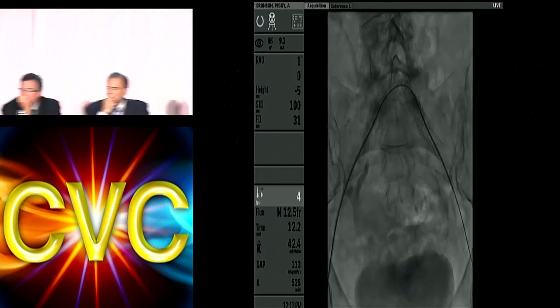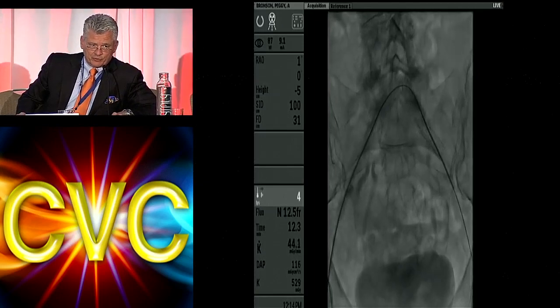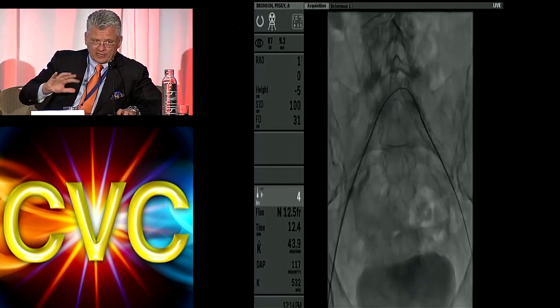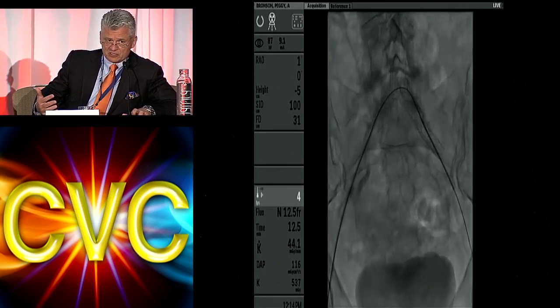So far, you've tried two wires, right? I think you still have wire options here. I wouldn't give up on the wire first. I would even try a Lundequist, one of those very stiff coat hanger wires, and if you can get it across, I think you may be able to remove it. But I would not puncture unless I had exhausted my wire options.